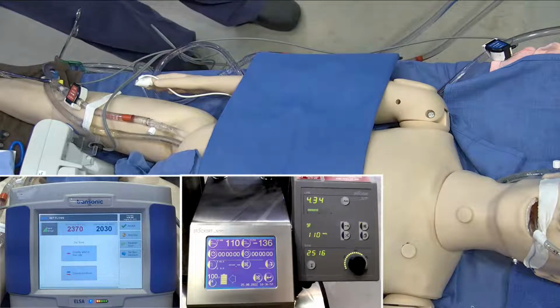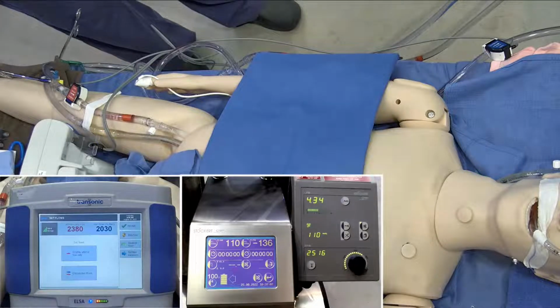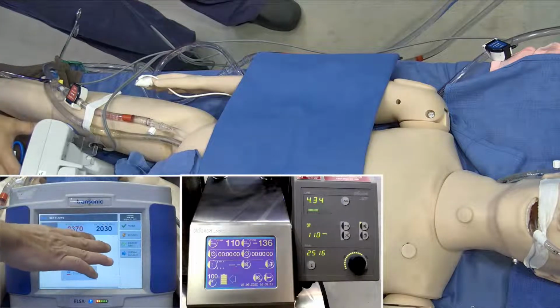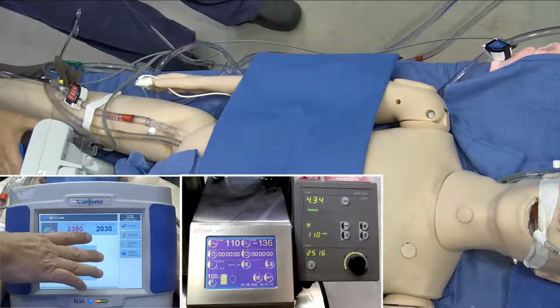But we all know that as the resistance of the patient changes, it's going to make a tremendous difference in terms of how this is going to flow. This can change very dynamically, very quickly, depending on the patient's vascular resistance, position of the head and neck. There's a variety of things that can affect these flows. And the ability to monitor them both together really makes a difference.